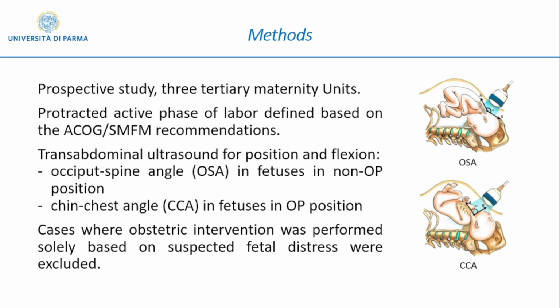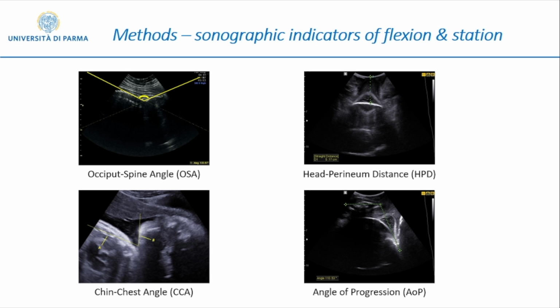Obstetric interventions performed solely based on suspected intrapartum fetal distress represented exclusion criteria for this study. In this slide, we show ultrasound images of the sonographic indicators of flexion and station which were measured for the purposes of the study.